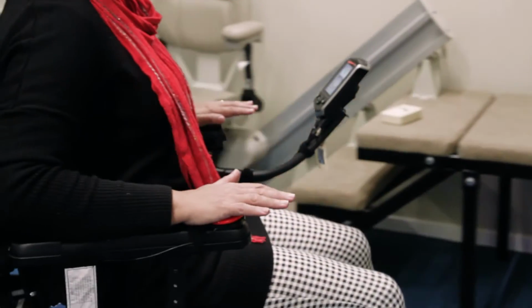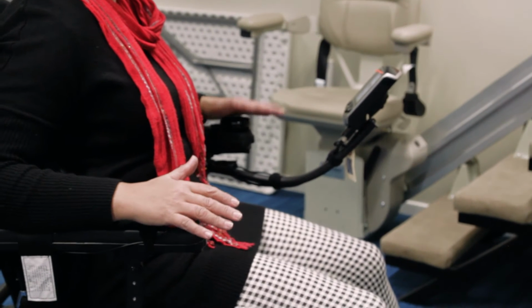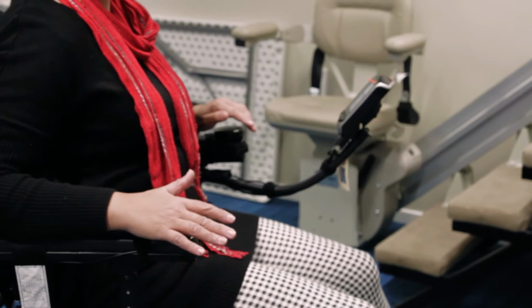So your drive types, and this is just briefly touching on proportional, which is obviously your standard joystick, in that the further forward you move your controller, the faster the chair goes. To non-proportional, in that, typically whether it's with a switch, you hit the switch, the chair is programmed to accelerate at a certain pace, you hit that speed, you stay there. So it's set functions, and you increase your speed by moving through your mode functions.